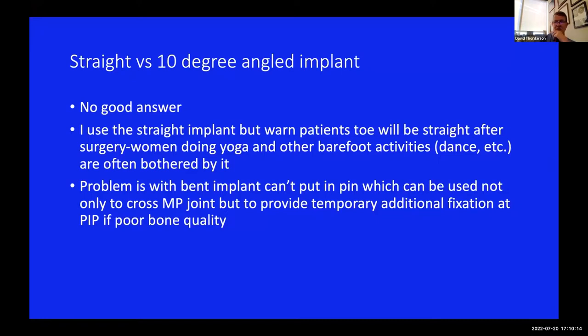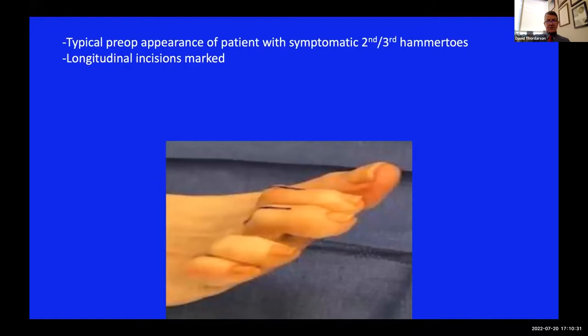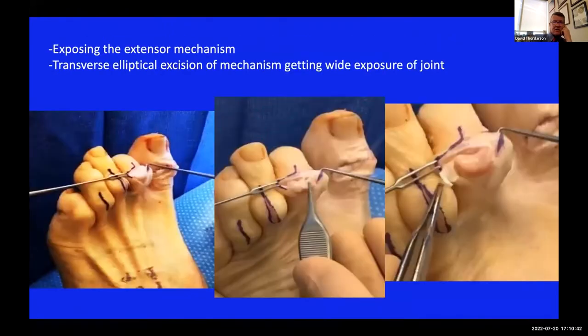I want to focus a lot on the technique because if any of you are going to try this, there are some pearls - minor things that if they don't go quite right will frustrate you until you learn. The pictures are unfortunately a bit blurry - I have my rep take these photos. Anyway, it's your typical appearance: the patient has second and third PIP fusions via a longitudinal incision. Once you make your incision, first order of business is to resect an elliptical piece of the extensor mechanism so you can see easier.